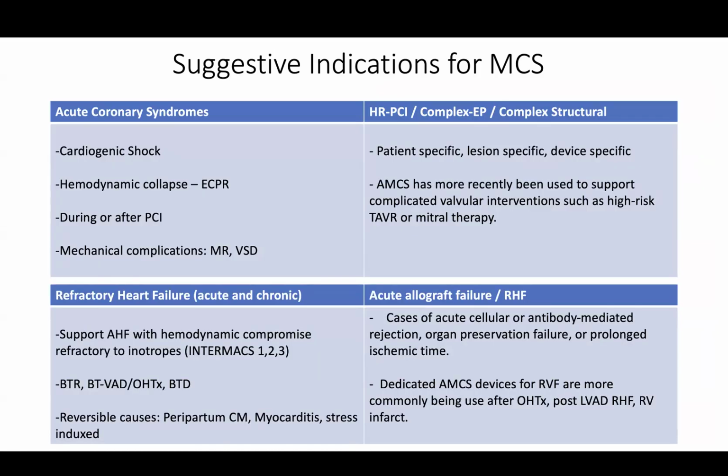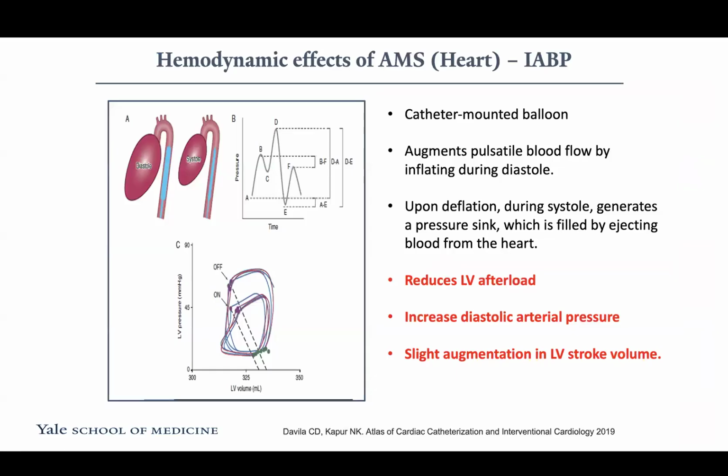So what I'll try to do is, every time I give this particular talk, I'm able to go over balloon pumps and a little bit of Impellas and nothing on ECMO. So I was thinking we can just go the opposite. So maybe start with ECMO, Impellas, balloon pumps, and then if we have any questions, we can go back to these things. These are just slides that I've been putting together over years. So I'm not gonna touch on everything.